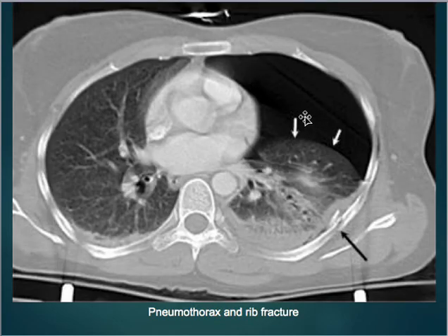And again, here's another one. So normal right lung here, and then the left lung has pulled away and collapsed. So those are severely painful for the patient. I mean, it's really hard for them to get a breath. It'll cause difficulty breathing, all that.